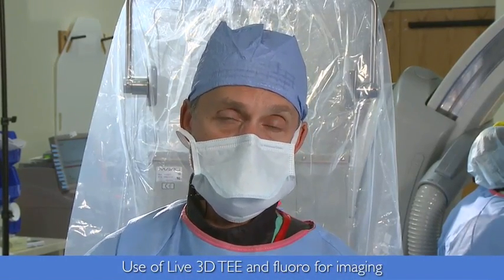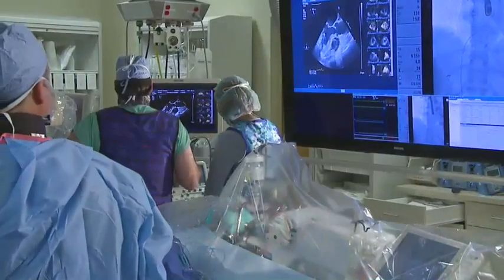And that will be performed by Dr. Robert Quaife of our Advanced Imaging Group.